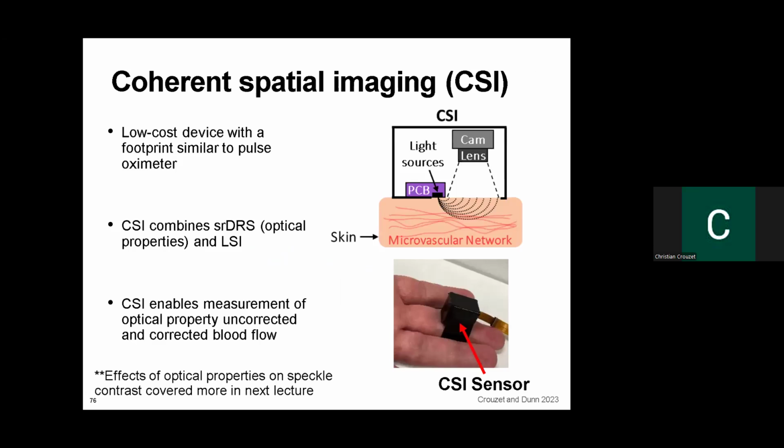So this is just from the finger right here. So it's a small area. So this would be more, being able to take it to the patient, put this on and let it go, kind of. So looking at a very small area. Within this whole device, you have your coherent light source, your camera, your lens, and everything.